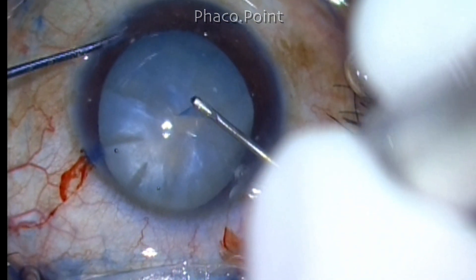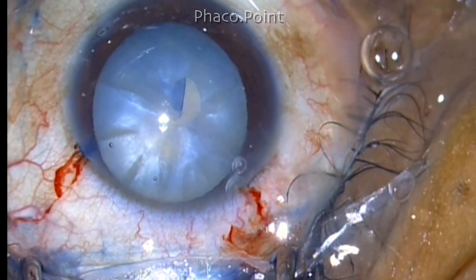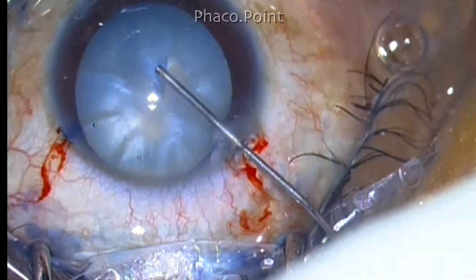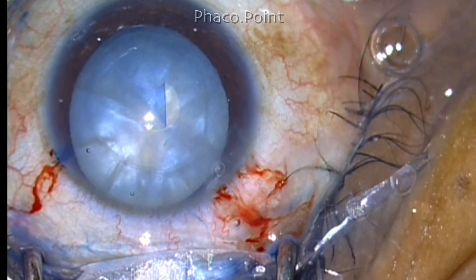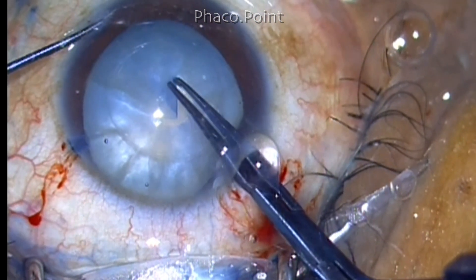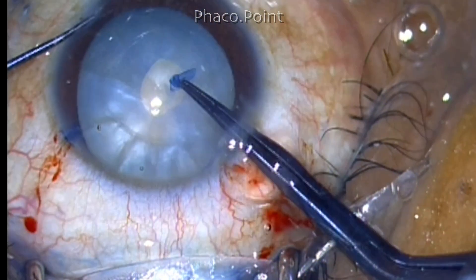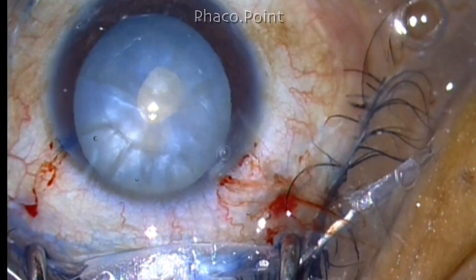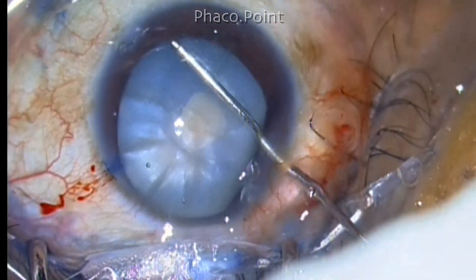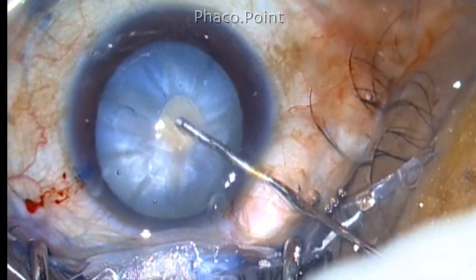Using a cystitome, either through the main port or through the side port, but when you go through the main port make sure that you do not separate the lips of the clear corneal incision too much. A small flap is raised; further Viscoat is injected over this in order to tamponade the flap and the central part of the lens. Using a Utrata forceps this flap is converted into a mini-rhexis of about two millimeters, which has got strong edges and is resistant to tear. The central part of the lens can be flattened with the use of a high viscosity or high molecular weight OVD.